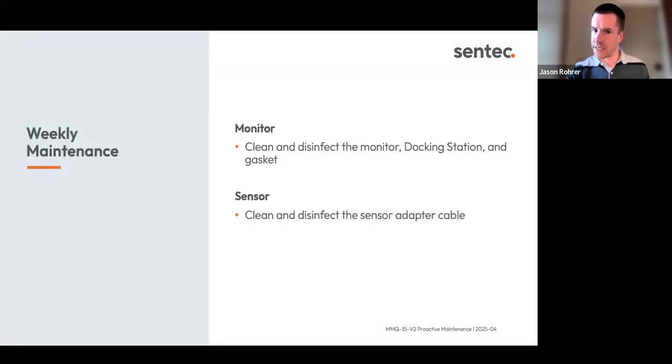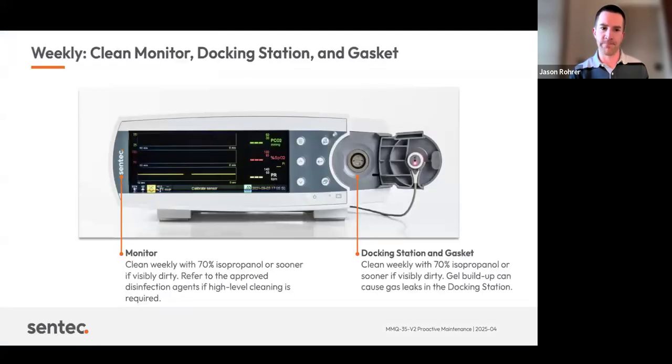Weekly, it's pretty simple as well. You're just going to want to clean and disinfect that monitor now, paying special attention to the docking station and the gasket, and I'll show you that in detail on the next slide, as well as cleaning and disinfecting the sensor adapter cable. So here's a picture of our SDM monitor.